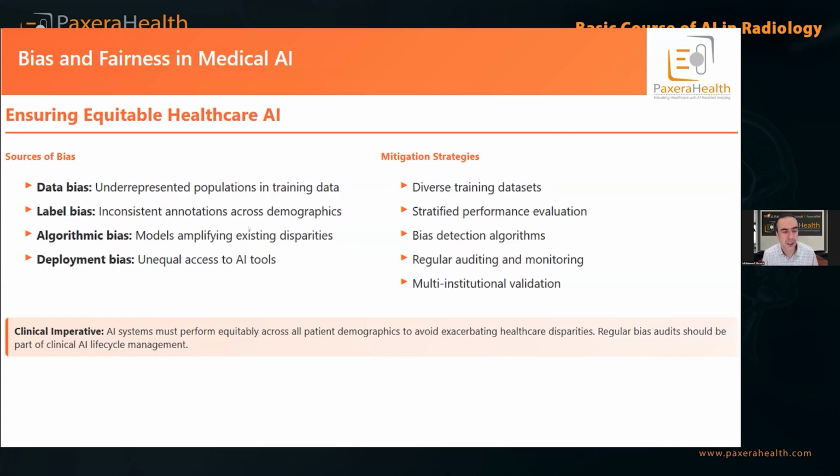One of the attendees was talking about the GAN, generative adversarial network, which is a protocol to generate not actually fake data, but test data, where the AI can invent medical images that have a specific problem.